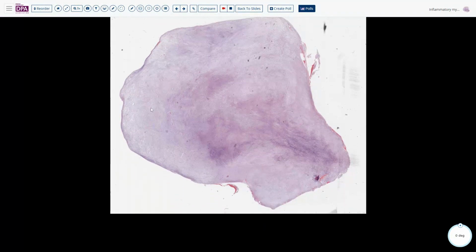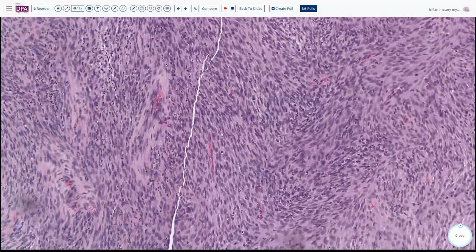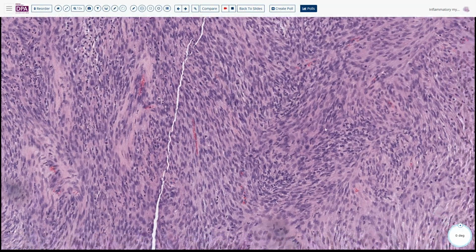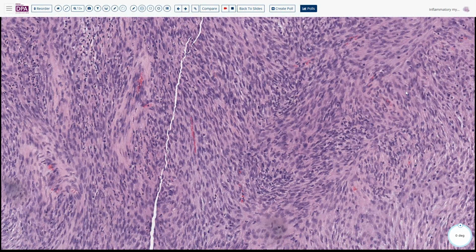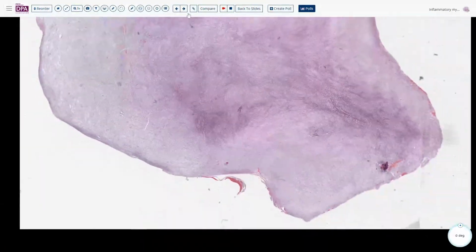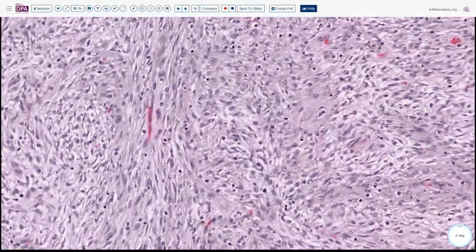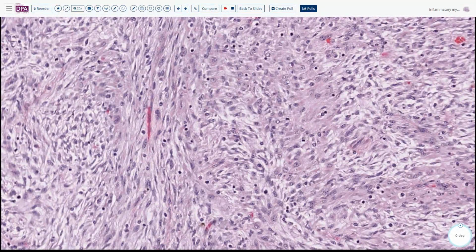Last example, also some hypocellular and hypercellular areas. In the hypercellular area, they form this fascicular growth. And even here, we can see a lot of inflammatory cells in the background. And for nuclear features, you can see open chromatin, conspicuous nucleoli. They all look the same.